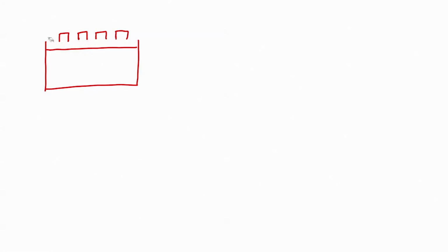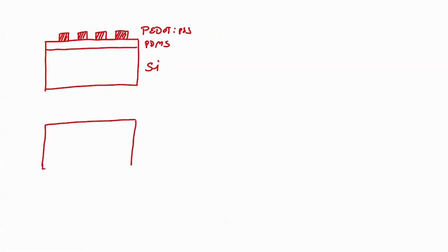PEDOT:PSS, PDMS, silicon. Now, what do we want? We want gold pads on the contact of the strain gauge, gold pads for the contact of the strain gauge.